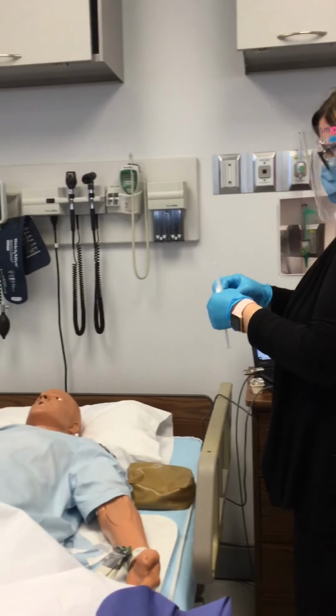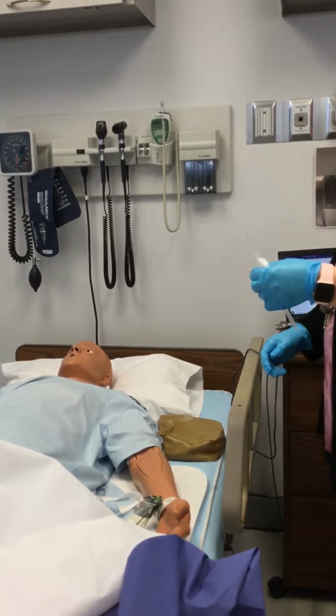Got my alcohol prep, I have my gloves on. Bed should be a little higher for me, but it's down at the foot. Use good body mechanics. So you'll have already demonstrated where your injection's going to be and said the landmarks. You're going to be using the Z-Track method. Sorry, my glasses keep falling down.